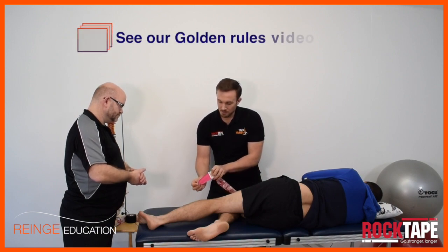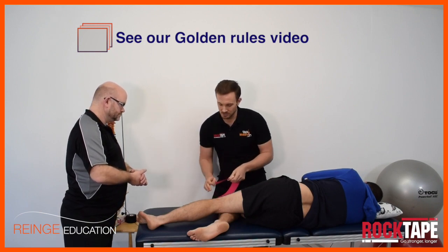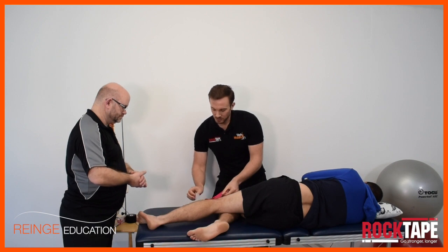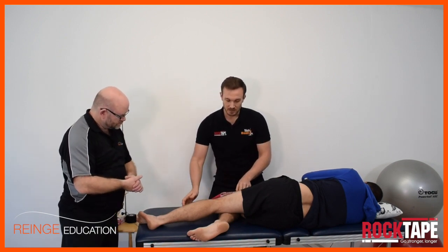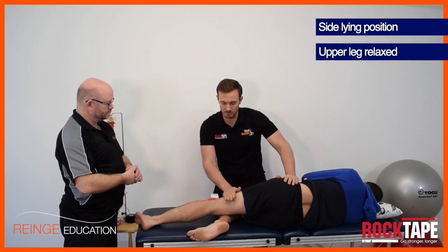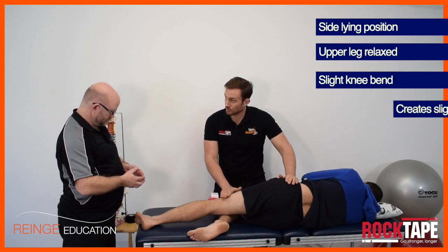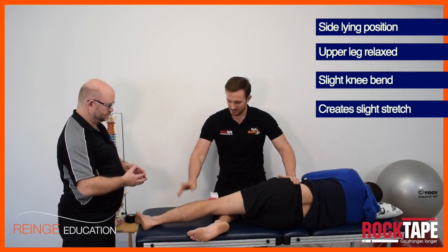Peel the backing paper away, stretching the tape and tearing the backing paper, then expose the glue side and stick it down in place. The position I've got my model in is side lying, with the leg draped down into a relaxed adducted position, a slight bend in the knee. This puts a slight stretch through the lateral leg and keeps them comfortable during the application.